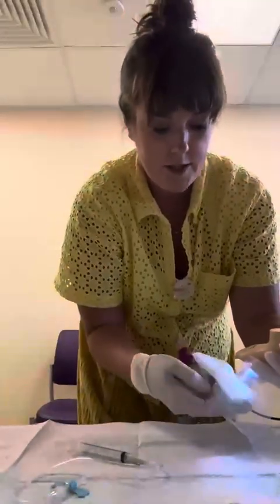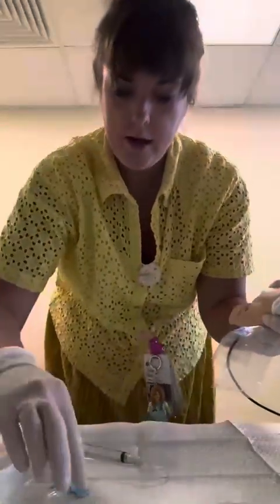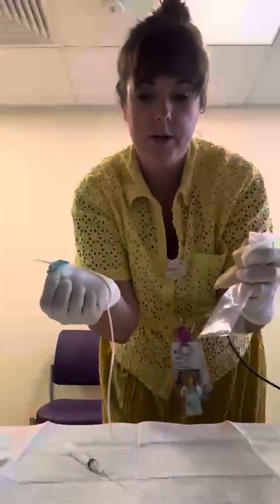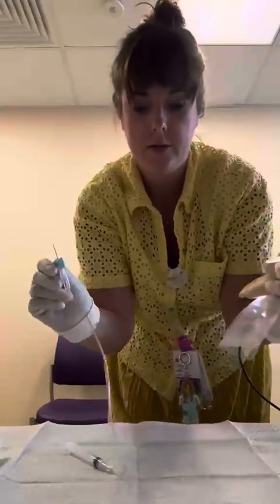And I need to readjust, so I'm going to grab this. Real life here, this baby is wiggly. Okay, so needle safety. You have to use your hot needles, so make sure you say hot needle, and then your partner is going to grab that off. I don't have one today, so we're just going to pretend that they did that. So hot needle, and then they're going to hold my syringe for me.